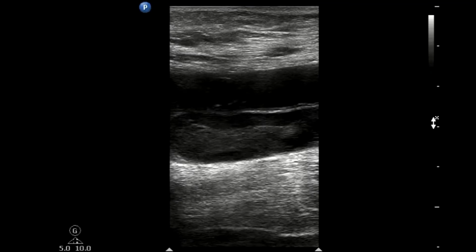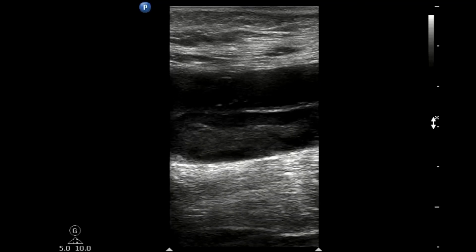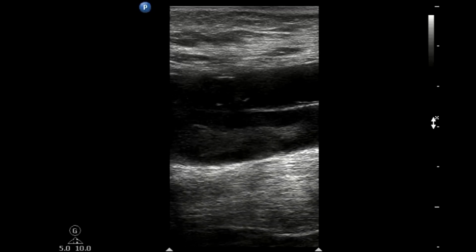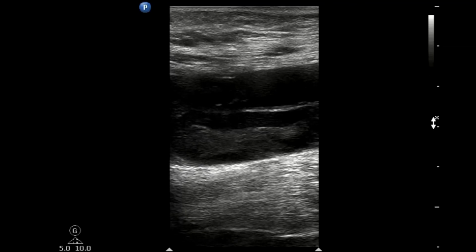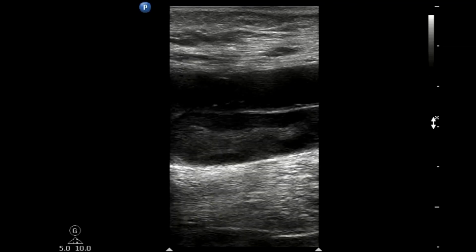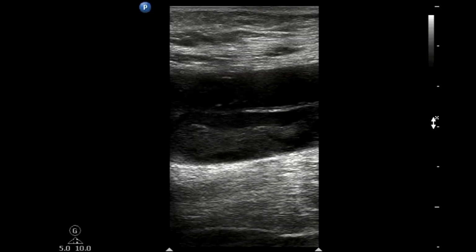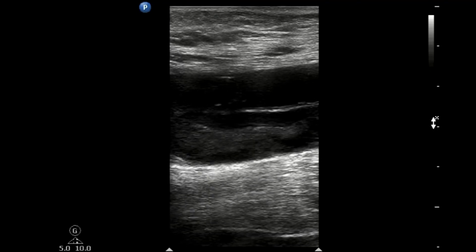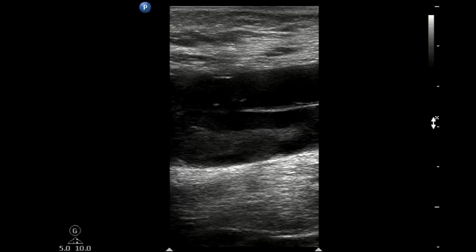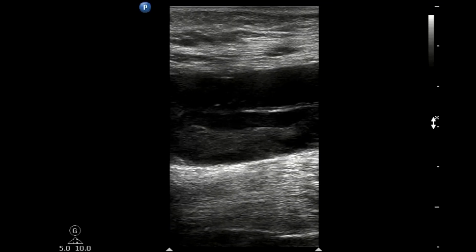Now, it doesn't mean you can't use it, right? There's definitely parameters that if you check and see some turbulence through the pelvic vessels, that certainly can suggest it. You can do a pre and post lesion duplex Doppler analysis and look and see if it exceeds a certain threshold of difference. But for just run-of-the-mill duplex ultrasound, this is going to get you the diagnosis of the DVT, but not necessarily make the diagnosis of May-Thurner syndrome. So we got to rely on some other things, right?